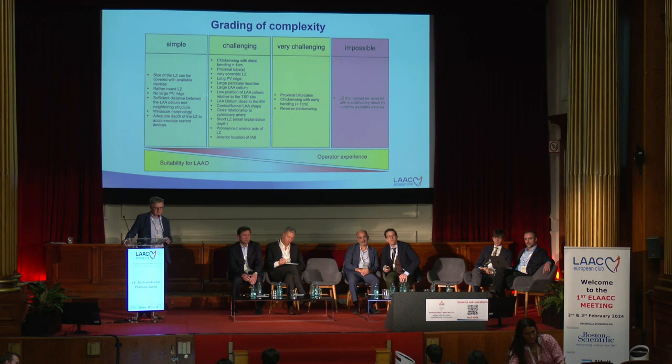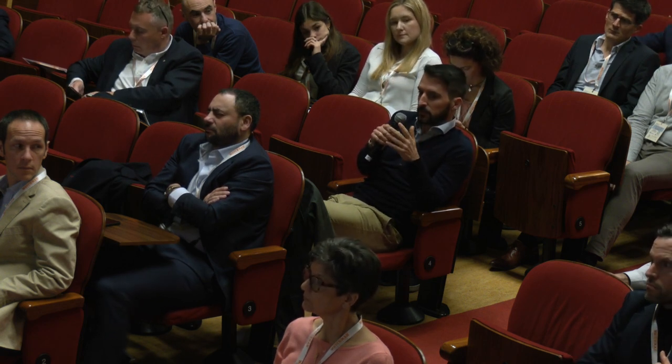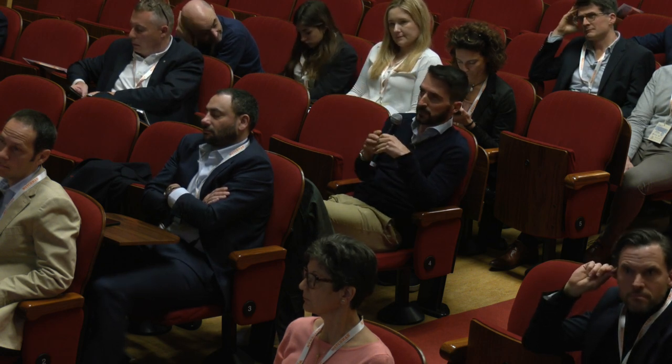I think we all agree that there are three main points. One is the point that Oleg brought up: whether the neck is narrow or wide, so you can say yes or no. Whether the angulation is sharp or not, yes or no, or whether there is a lot of space behind it, so it's very forgiving, or not. So three criteria, in my opinion, are the most important. If you say yes to all three, then it's very challenging. If it's two, it's challenging. If it's one, it's rather challenging, and if it's zero, it's simple. So that would keep it simple.